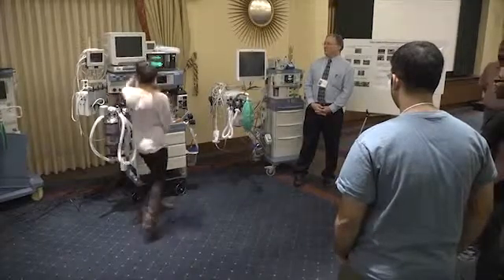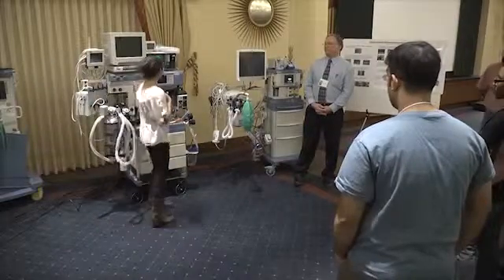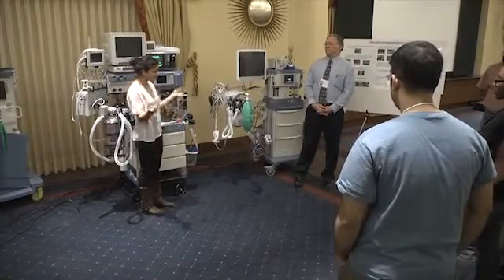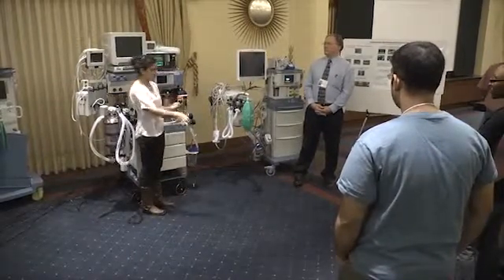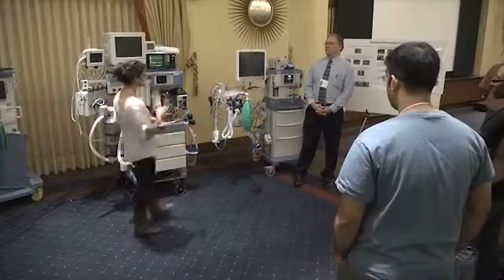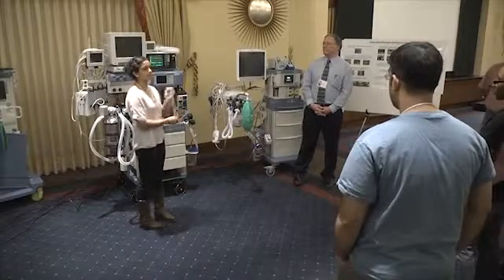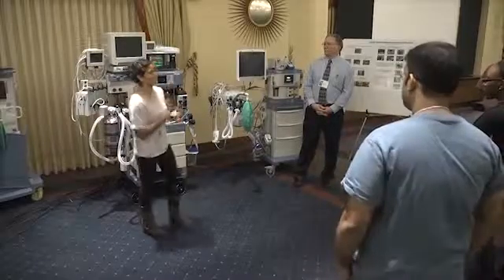But even without this, say you were on the Apollo where it's all built in and you get those nice yellow waveforms, this is something that I did, and I'm certainly not saying that everyone has to do it, but I always did because I found there are a lot of issues with these little things, with kinks or this being full. Before every case, at the institution I trained at, we often had to set up everything because our techs were few and far between. I'd blow into it and make sure I got a waveform. Then I would know that I'm at least mostly set to start the case, but most of the time you always have issues with this during the case also.